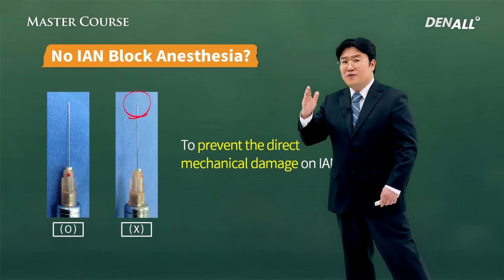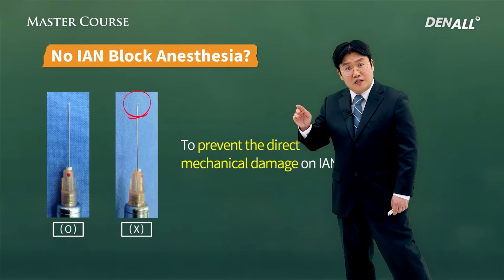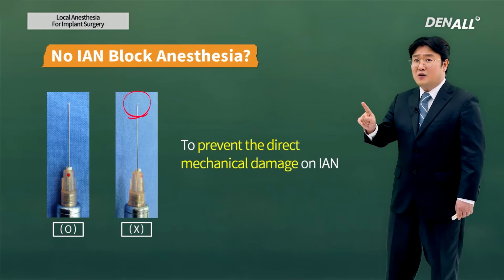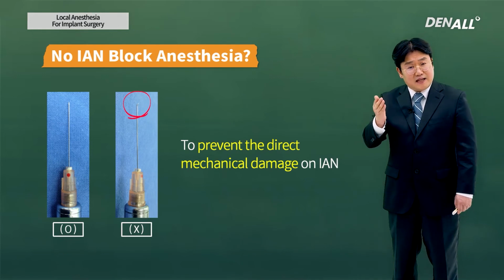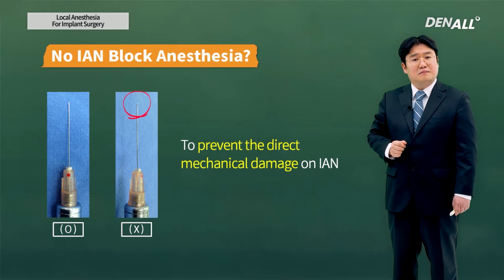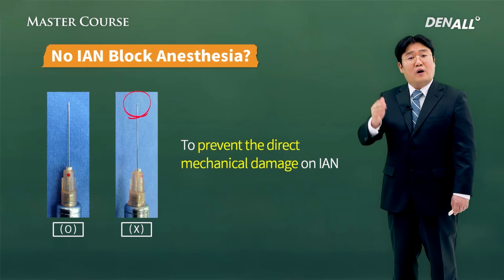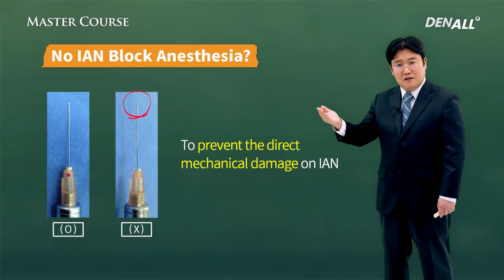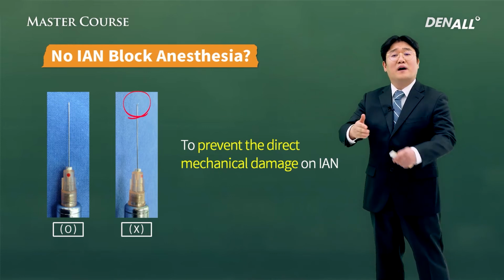If this type of needle directly touches the inferior alveolar nerve, it will be injured for certain. Therefore, here's my first suggestion to you. For all block anesthesia, including the inferior alveolar nerve block anesthesia, a clean needle should be used. You'd better not use a needle deformed or bent as it touched the periosteum.